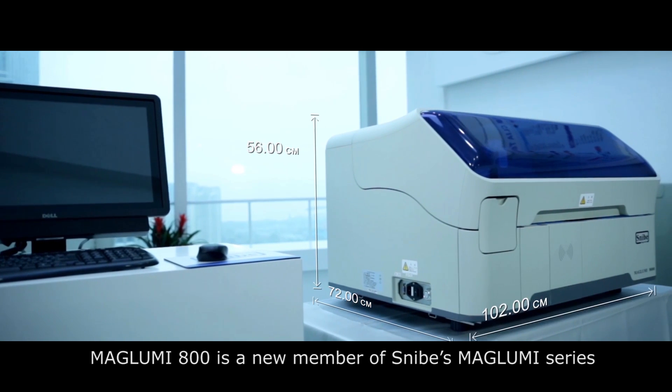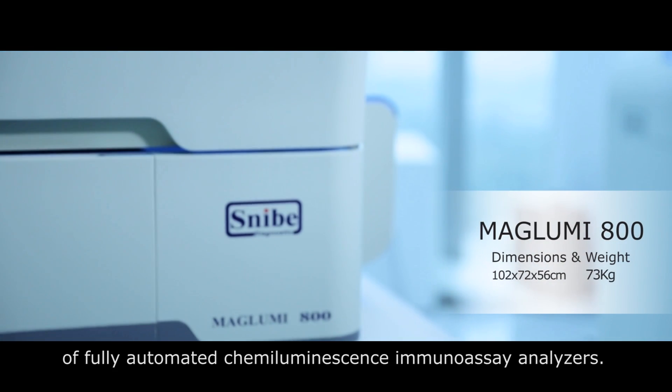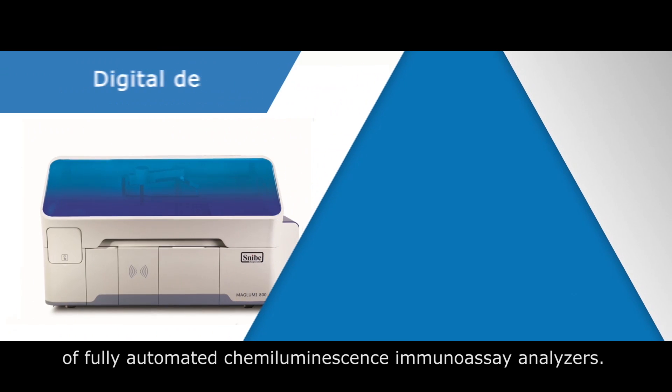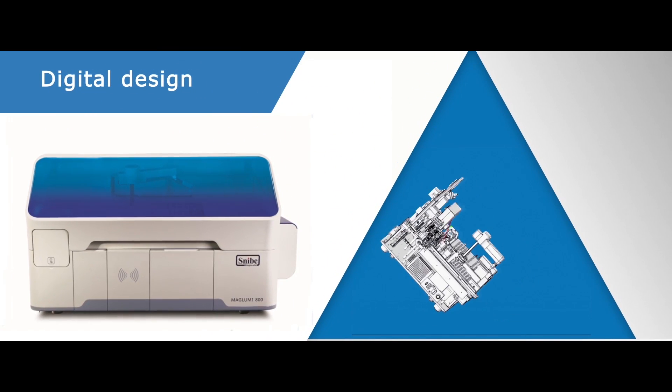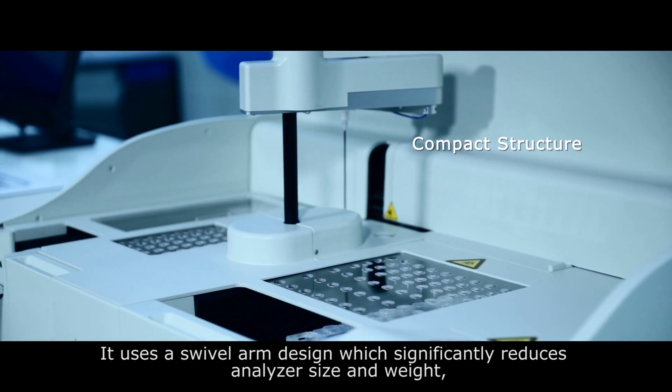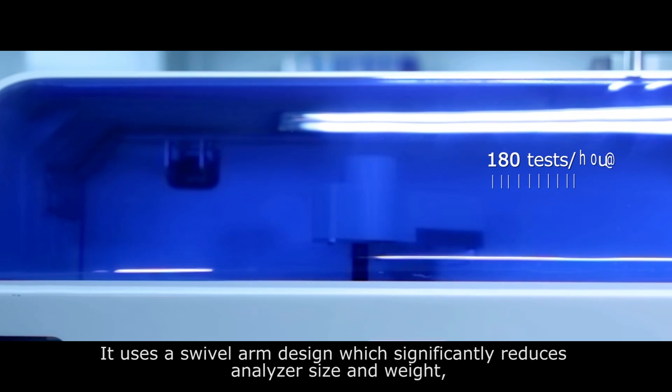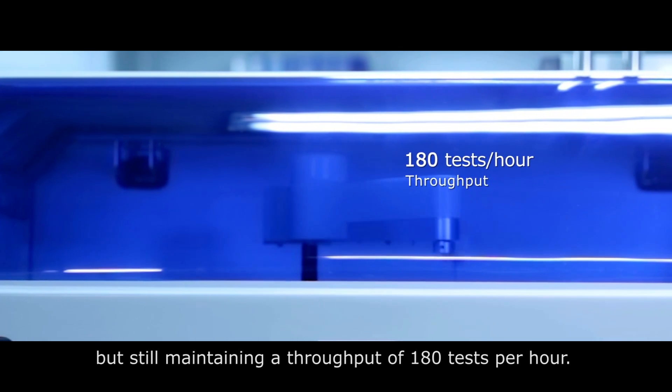Maglumi 800 is a new member of Snibe's Maglumi series of fully automated chemiluminescence immunoassay analyzers. It uses a swivel arm design which significantly reduces analyzer size and weight but still maintains a throughput of 180 tests per hour.